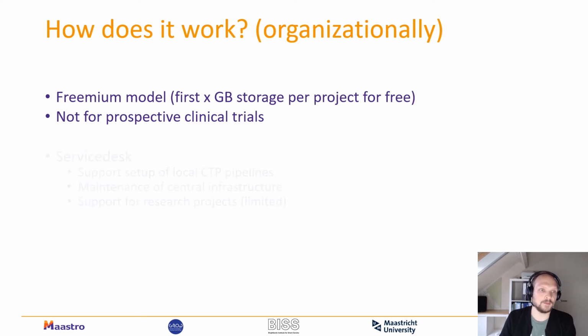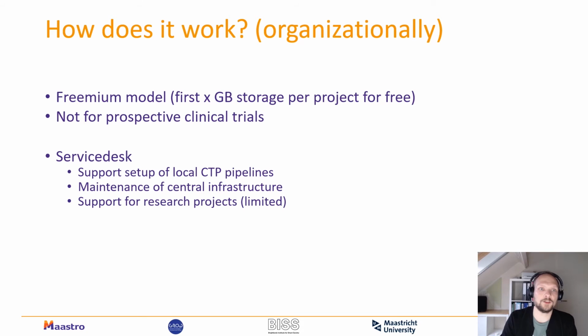The second part brings us to the service desk. What is available is a service desk to request or set up a project. The service desk also gives support for setting up this project, especially the local CTP de-identification pipelines, which need to be installed locally within every hospital, because we see that most of the time things can go wrong.